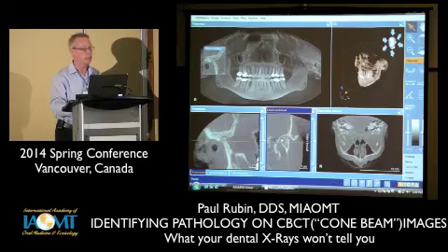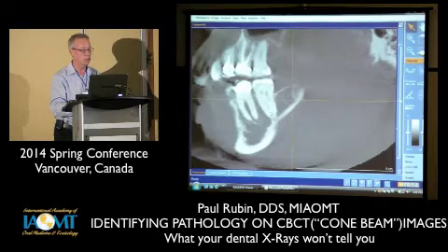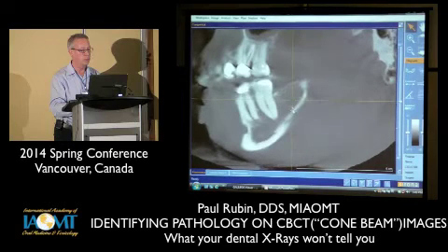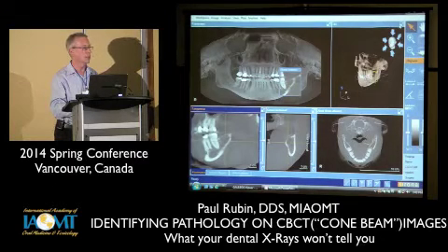You can look at any place along here. You can look at, of course, the bone where the third molars were extracted. And this is one of the best ways, I think, to look at and evaluate the bone for potential cavitation areas. You can look at the trabecula of the bone in 3 different kinds of views and get a much better 3-dimensional sense of what's going on with that bone to be able to advise the patient, is this a likely cavitation?